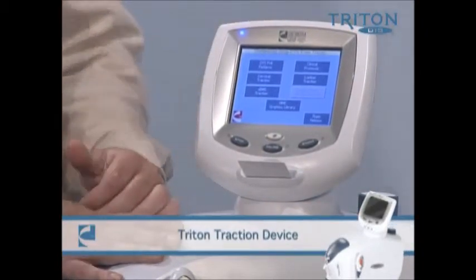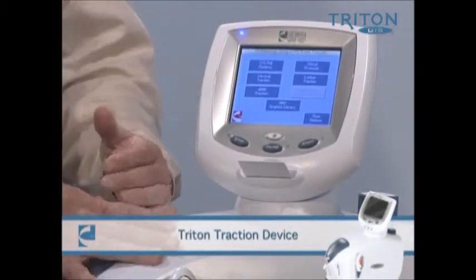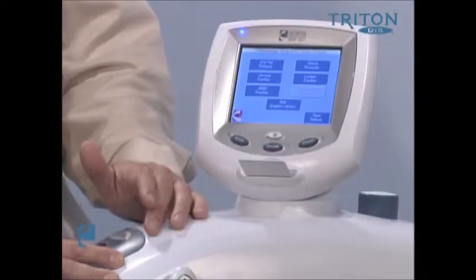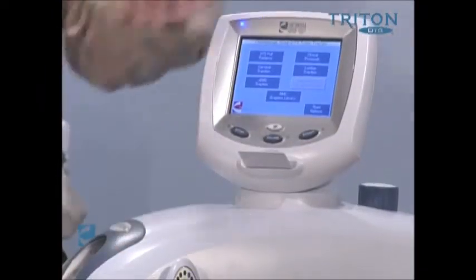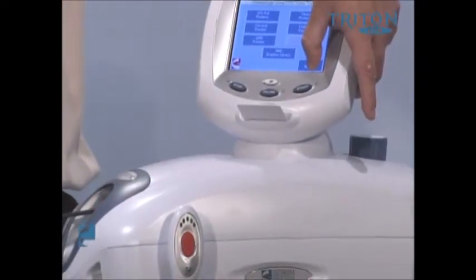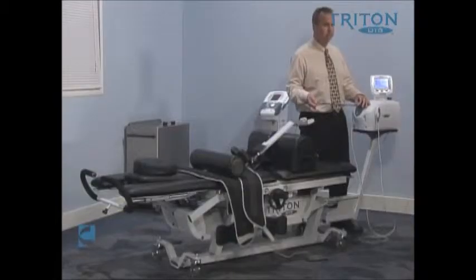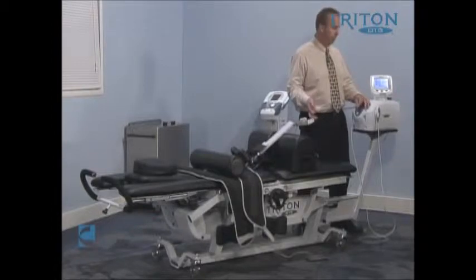We'd like to move to the head, as it's called. The head contains the processing system as well as the winching system. It's very similar to a winching system where there's a cable attached to a device that not only measures tension, but can also measure the speed and the rate of change of speed.